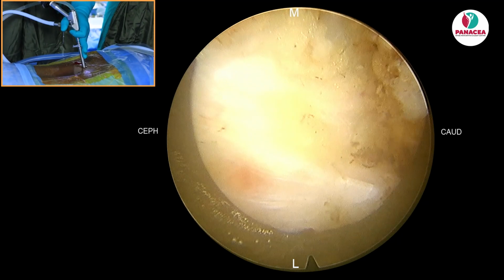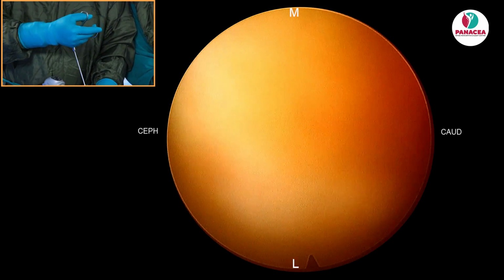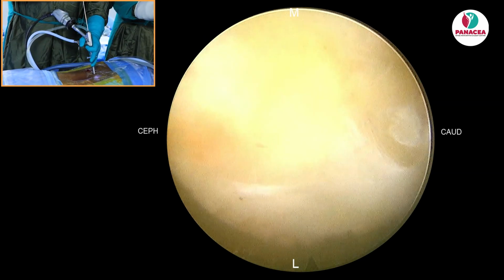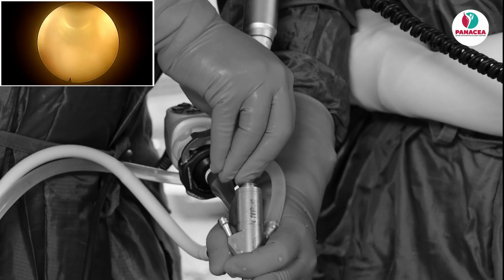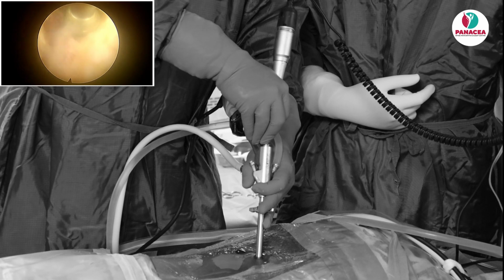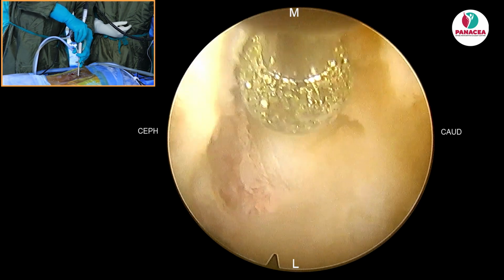So, there is a flimsy fatty layer between the erector spinae muscles and the ligamentum flavum. Now, I am taking out the soft tissue over the IAP. So, before I start the burring, this is IAP. So, I am doing hemilaminotomy. You could see with a 3.7 mm diamond burr. So, you have to observe the hand movements. The overall game is all about using the working sleeve in order to retract the soft tissues.